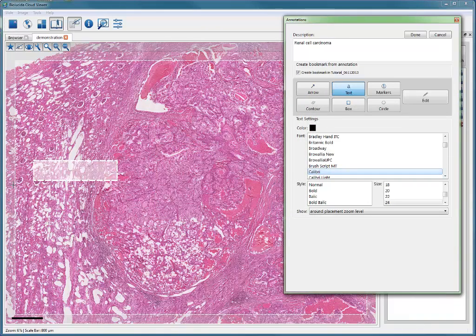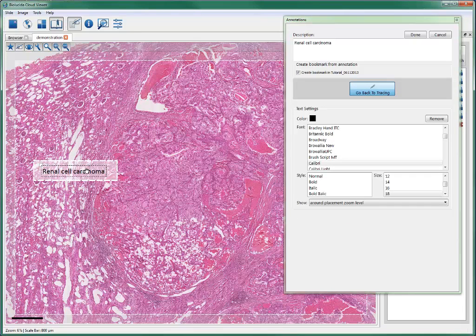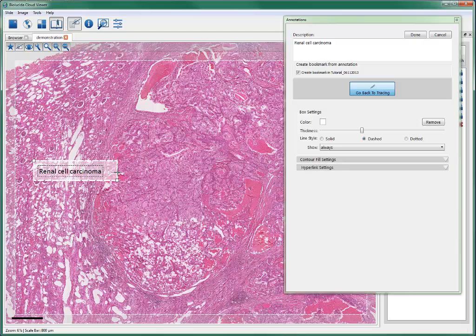And it's still on my Calibri font. Maybe make it a little smaller here. And first I'm going to click outside and get the text written. And then I'm going to edit it and move it into that box. I can also edit the box at the same time.